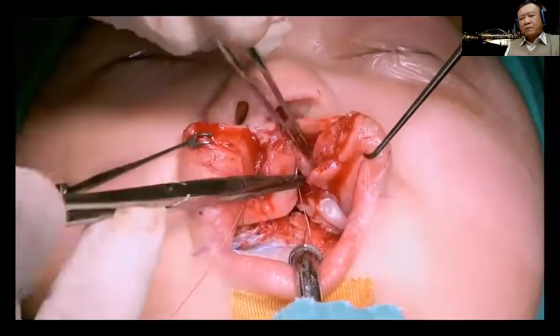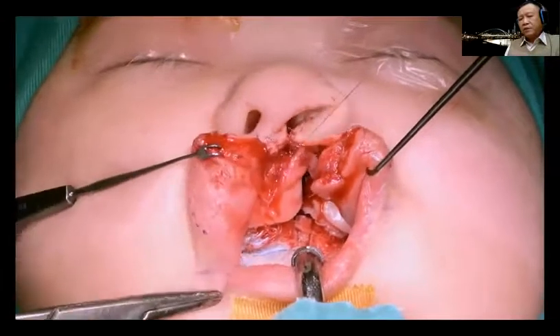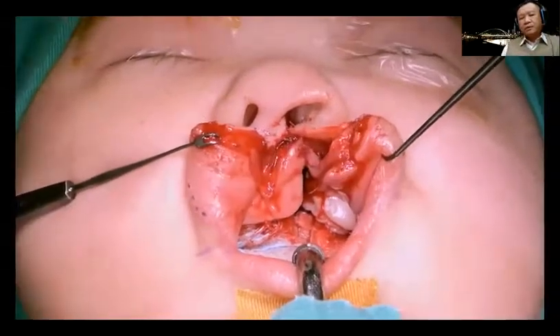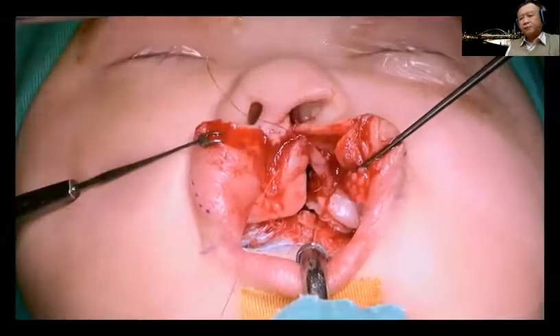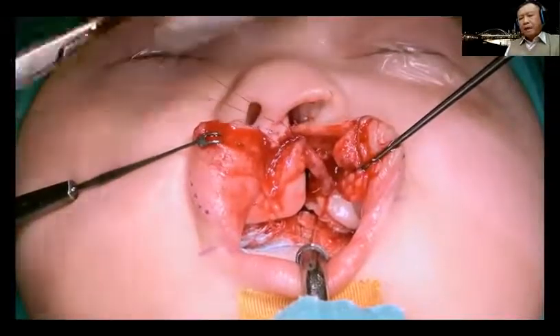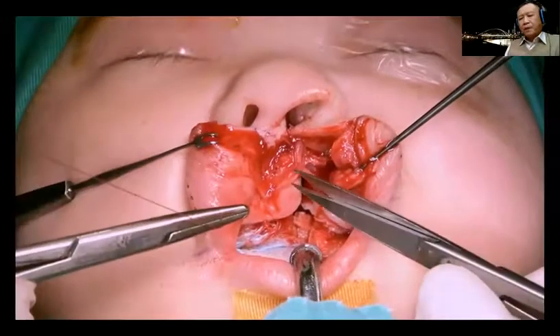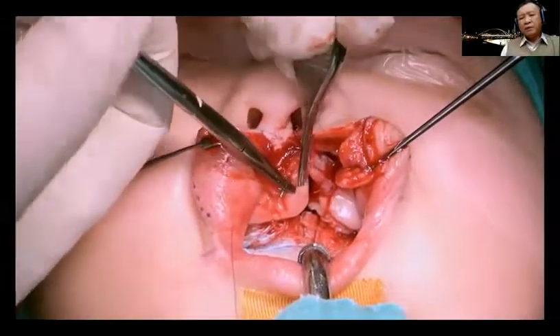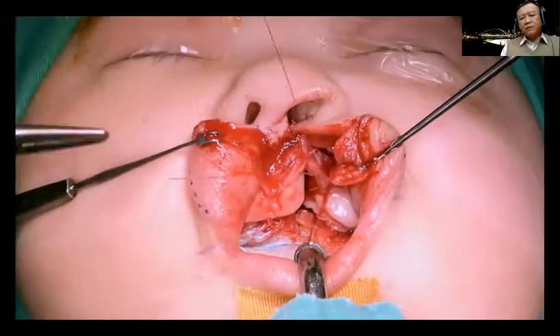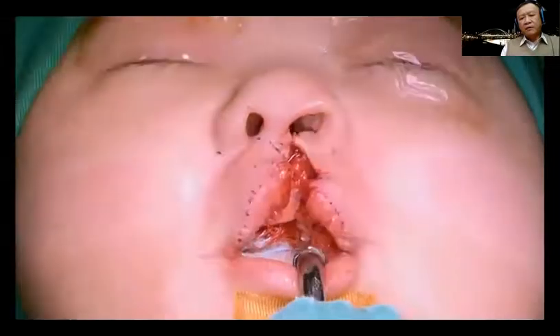And certainly in the future, 9 years later, when we do the ABG in this alveolar cleft area, there's no problem in the dissection. So no problem at all. Do not worry about the turbinate flap and the nasal mucosa flap here. So you can see that the nasal floor is well supported, and I gradually close these three composite mucosal flaps. And you can see below this closure is the small alveolar defect. This will be the future nasal alveolar fissure with the alveolar cleft that will be closed at 9 years of age with the alveolar bone grafting.